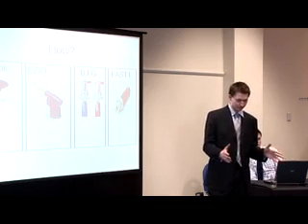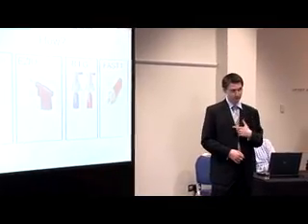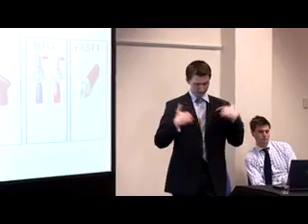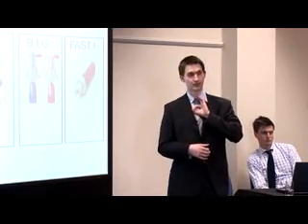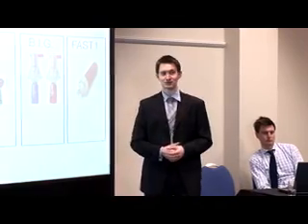It's a sternal device. So you needle at the patient's head. There's a little dressing, which is a little landmark dressing that you put on. It's a kind of inverse triangle, which goes on the sternal notch. And then there's a hole in it, a circular hole, which shows the exact place to push. And then you just push with a constant pressure, and it goes through the sternum.